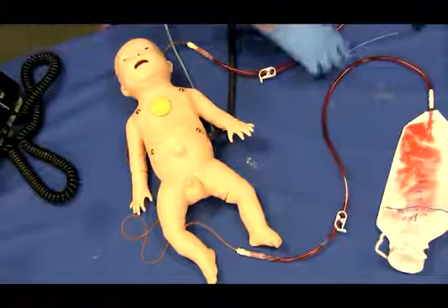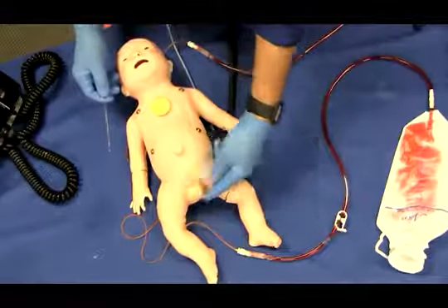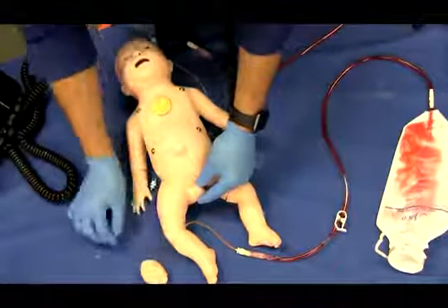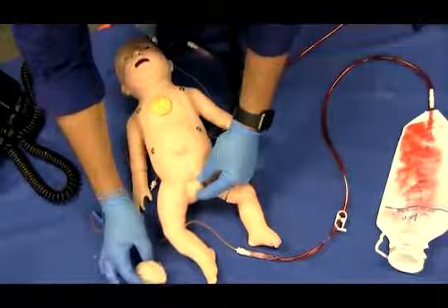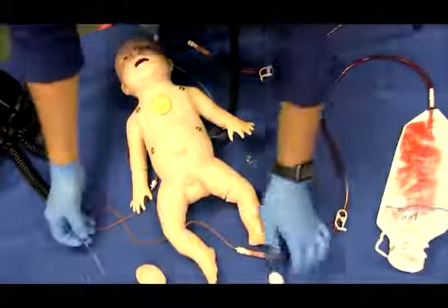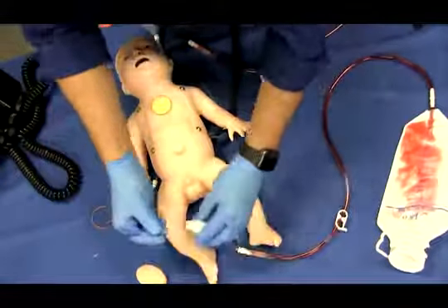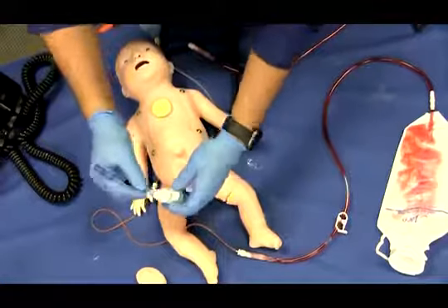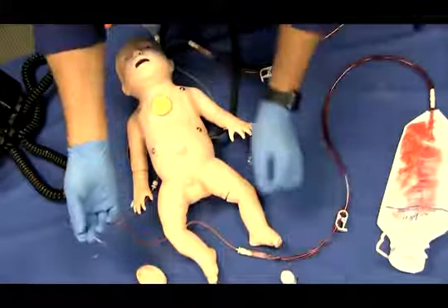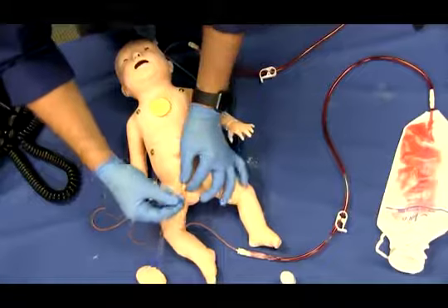Urinary catheterization. The interchangeable genital inserts are for catheter placement practice only and not designed to deliver or eliminate fluids. Select either the male or female genital insert and fit into the body of C.H.A.R.L.I.E per previous setup instructions. Lubricate a 5 French straight urinary catheter and insert following institutional guidelines.